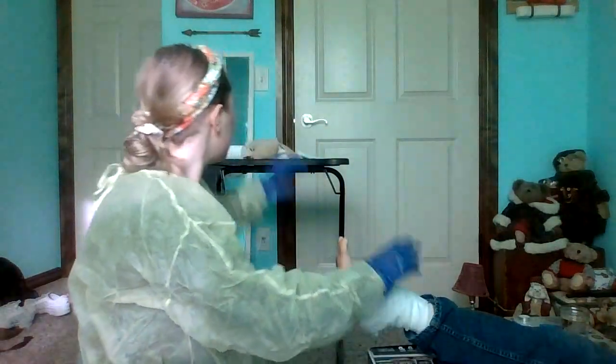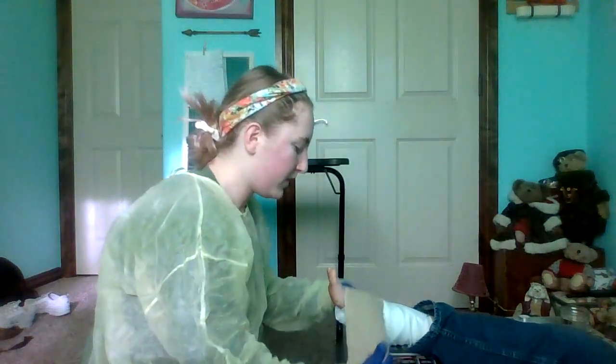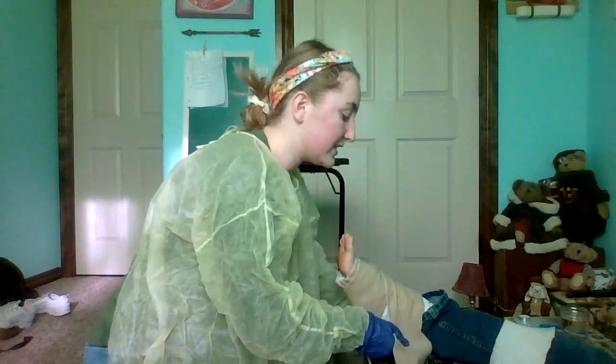There you go. And then we'll top it off with an ace bandage to help protect it and keep everything in check. So again, you can start off with middle of the foot, wrap it around once or twice, and then do that figure 8 pattern again. A couple of things to make sure on is to do a sensation test with your patient. That way the bandage isn't too tight, because if it's too tight, it can cut off circulation, and that would be really bad. And it's not fun.